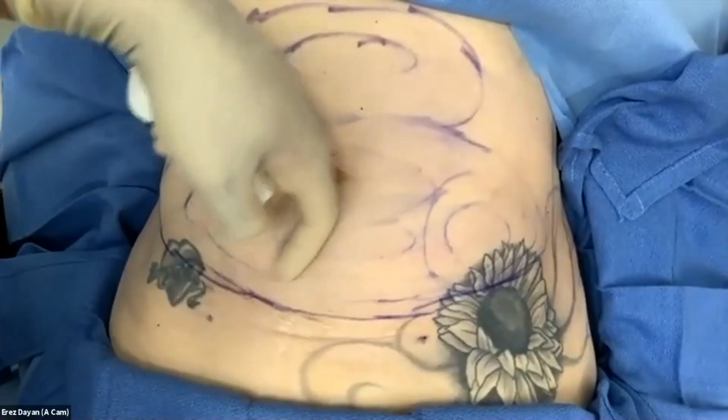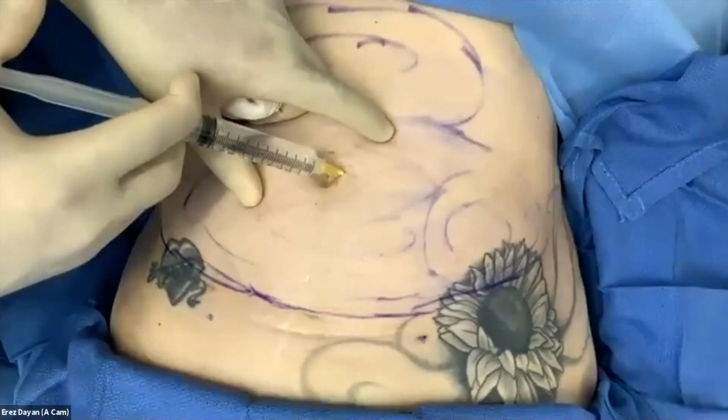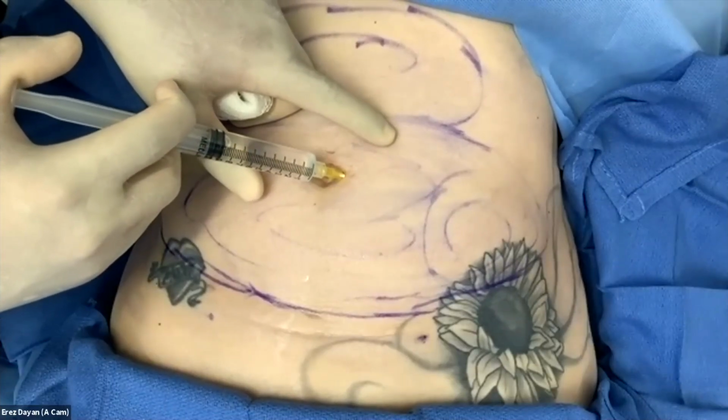Do the same thing a little bit on the inferior and lateral side towards me, and then we're going to do a little supraumbilical area here. So a little pinch. So it's all the same. Kind of go straight in, a few cc's. So she had 2 Valium as opposed to the other patient, so she should be pretty comfortable.